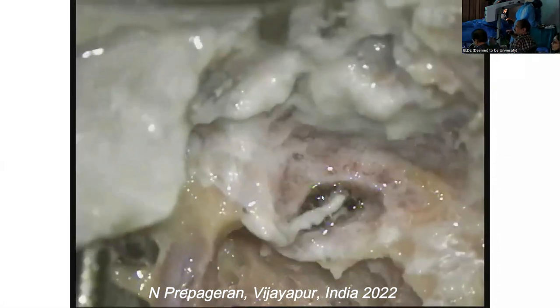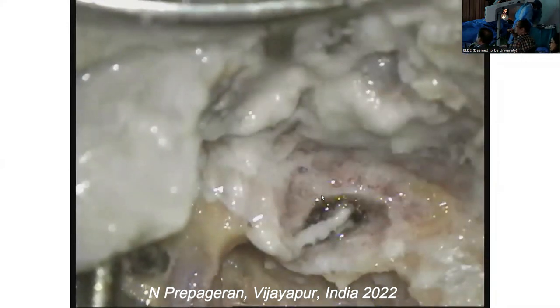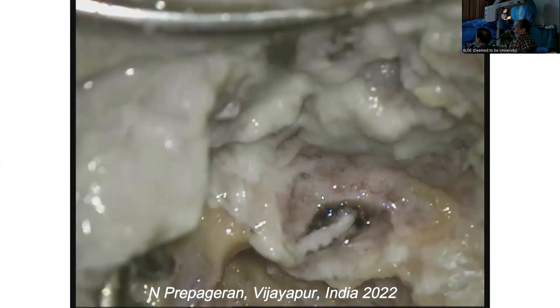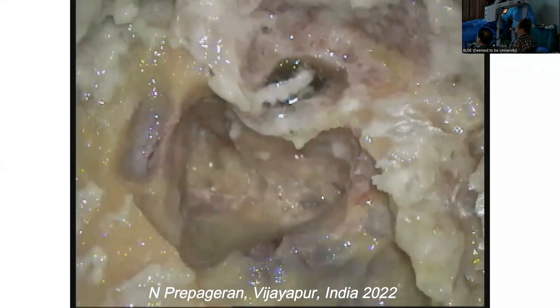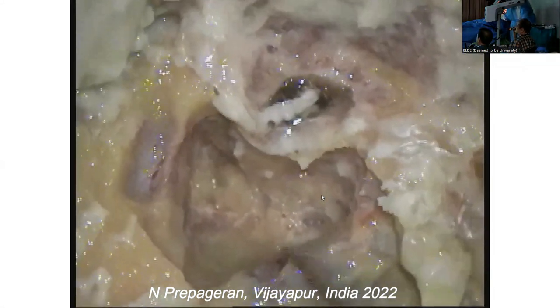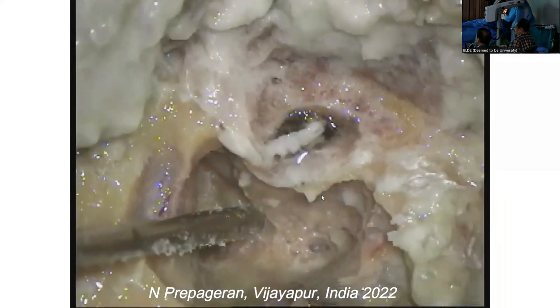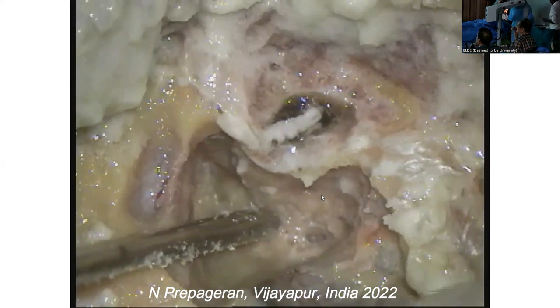But can you see how fast we did the dissection? It's all anatomy, nothing but anatomy. We all speak different languages, but there is one language that all surgeons speak. Can I have a face elevator or something bigger? Something big, this is too small. I want to elevate the bone. So what you want to do now is push the bone over the sigmoid sinus down.